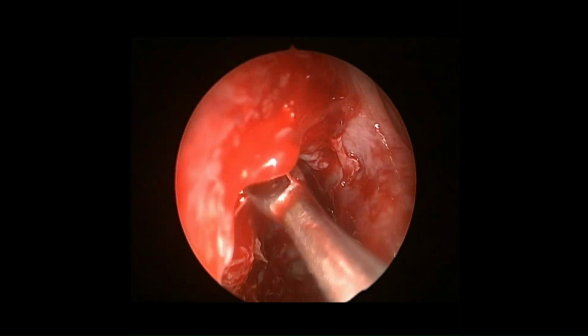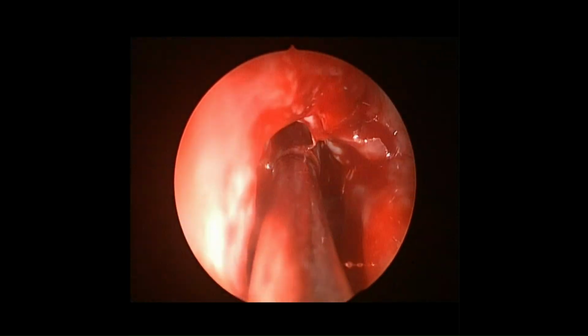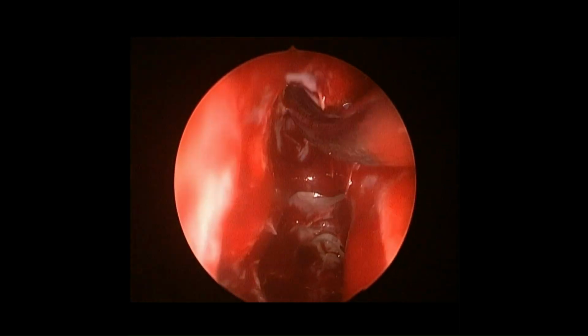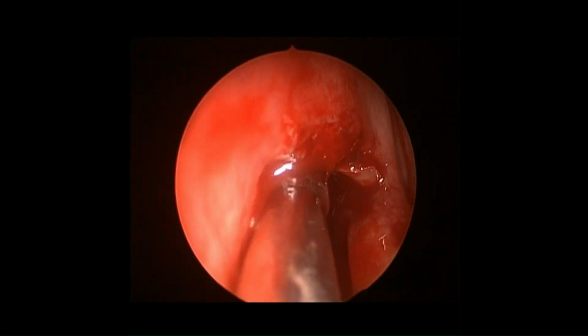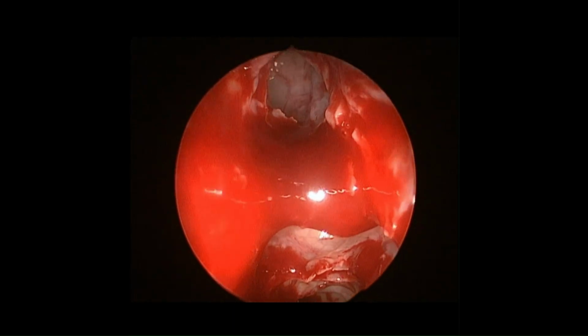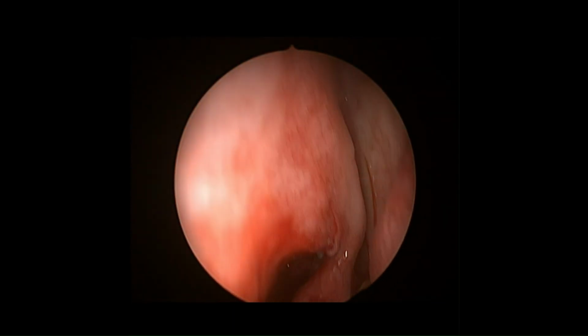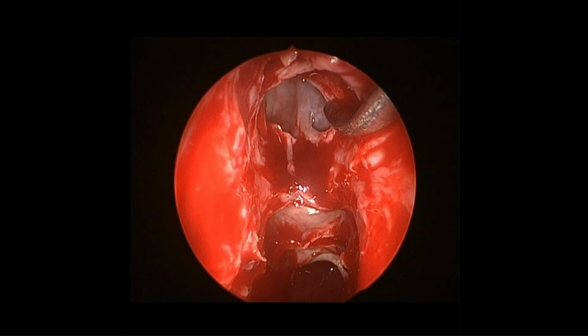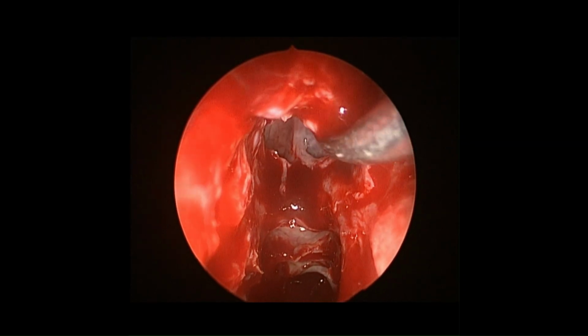The same steps are followed on the right side. First step is identification of the agger nasi cell. Second step is removal of the agger nasi cell. Next step is identification and widening of the frontal sinus ostium in medial and anterior directions. Care is taken to avoid injury to the lateral boundary at the orbit and the posterior boundary, the anterior ethmoid artery.